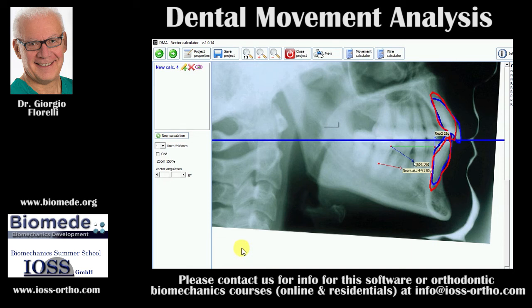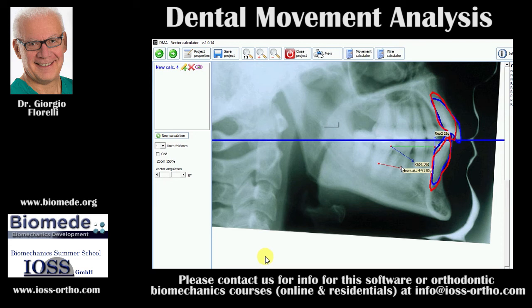These two vectors are not very difficult to obtain. If you want to work with TADs, you might place the TADs in this area and work with this direction — acknowledging there are 3D complications, but keeping it simple for now. I'm working in two dimensions — I know it's not the whole story, but this is a first introduction to two-vector mechanics. If you combine this with an uprighting cantilever able to slide and attach here with this kind of activation, you get exactly this force system.